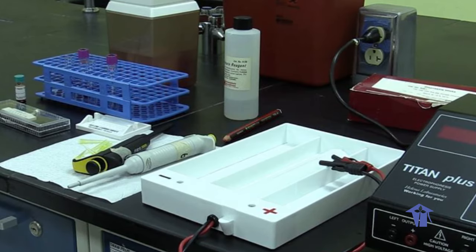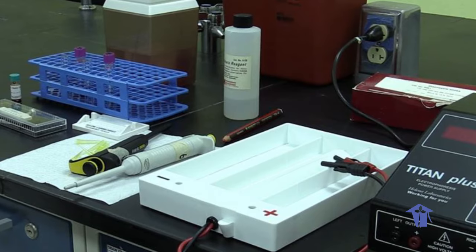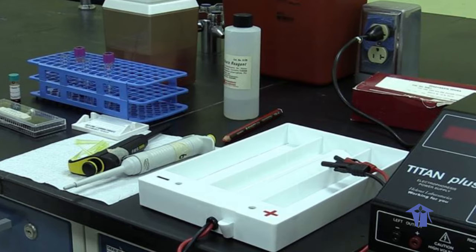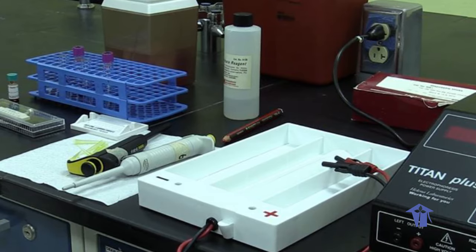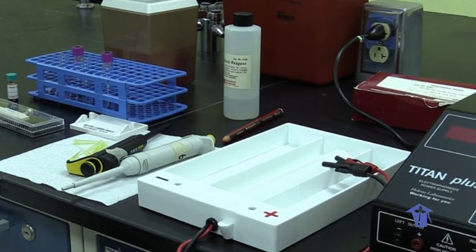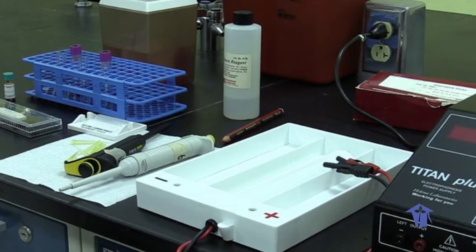And the principle of this electrophoresis is that hemoglobin at an alkaline pH is negatively charged when it is subjected to electrophoresis, and therefore it will migrate from the cathode to the anode. And structural variants within the hemoglobin that you are measuring will have a change in charge on the surface of the hemoglobin molecule at alkaline pH, and therefore they will tend to separate on the acetate cellulose paper that we use.